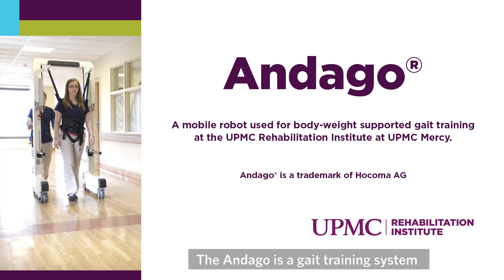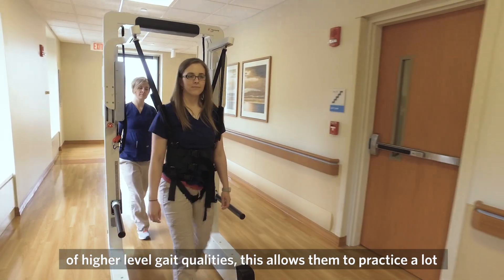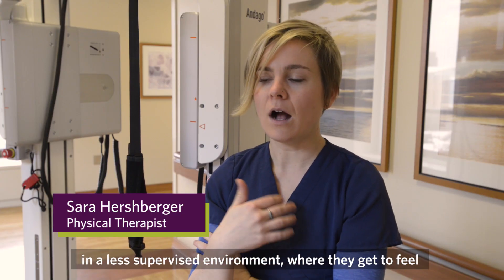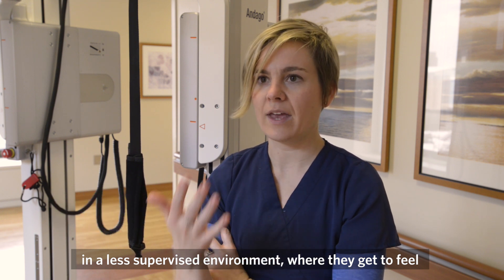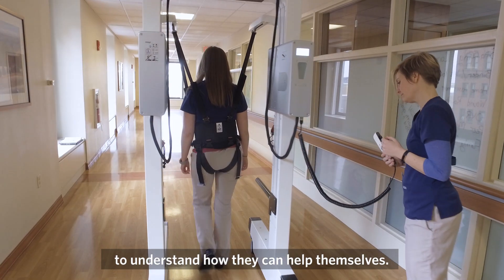The Andago is a gait training system that allows us to be a little more hands-off. For patients who just need to get the practice of higher level gait qualities, this allows them to practice a lot in a less supervised environment where they get to feel what their mistakes are and it allows them to start to understand how they can help themselves.